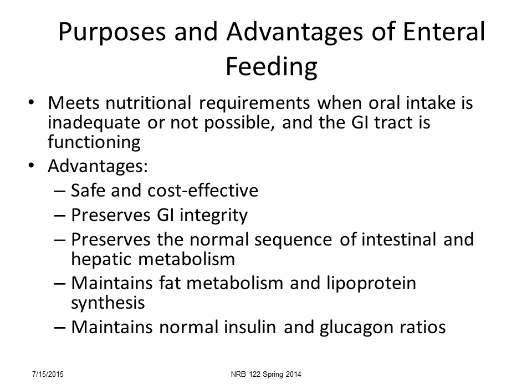So what's the purpose and advantages of enteral feeding? Remember, in class, you talked about parenteral nutrition, TPN, PPN. That's parenteral nutrition via a vein. Enteral means food via the GI tract, liquid feedings, tube feedings via the GI tract. And in nursing and in nutrition, we always want to use the GI tract because it's designed for feeding and nutrition. So therefore, the saying, it's a very old saying, but it's very true, if the gut works, use it.